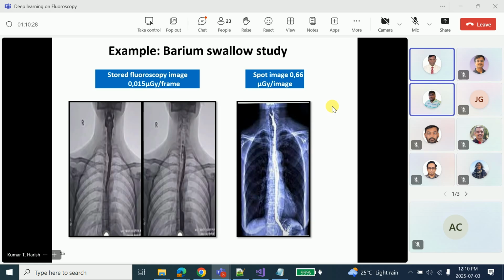It's not possible. Our limit is 43 by 43. That is our detector size. For dynamic, and whatever we have as the static plate, it is 14 by 17. So we don't have a detector that can capture right from your head to your abdomen.